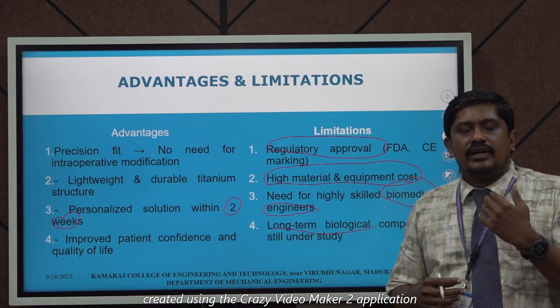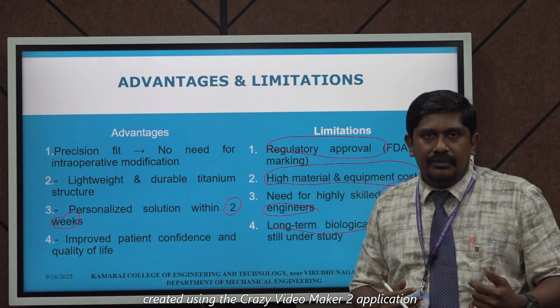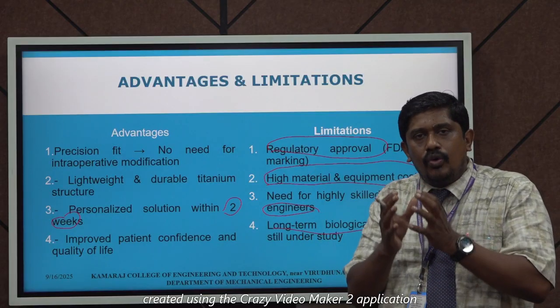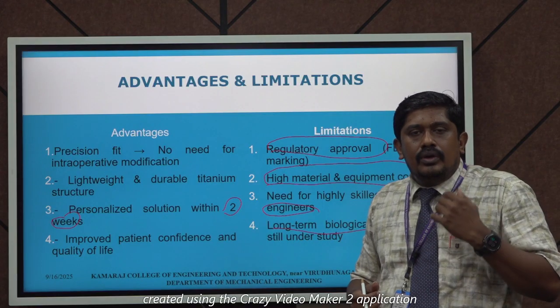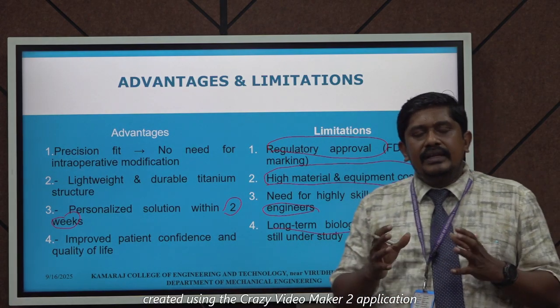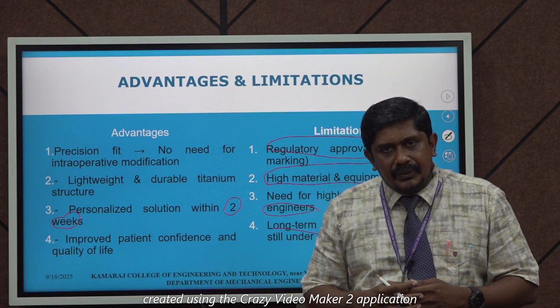Long term biological compatibility is still under study, because compatibility issues are there. Recently we are using only PMMA and titanium products, but is it sufficient? No, we need to find more materials to implant. So biocompatible material research has to be improved to overcome the current issue, and this is the real case study of metal additive manufacturing in the field of additive manufacturing. Thank you.